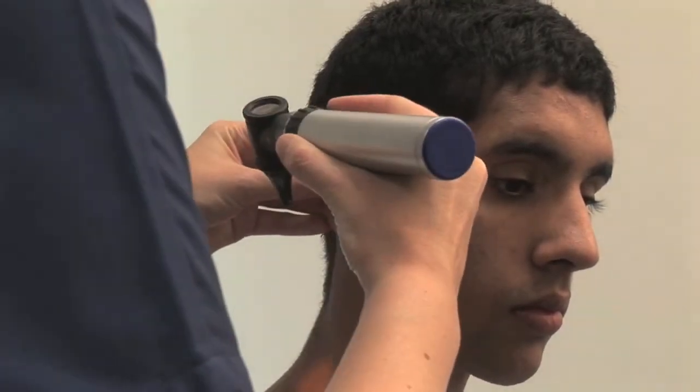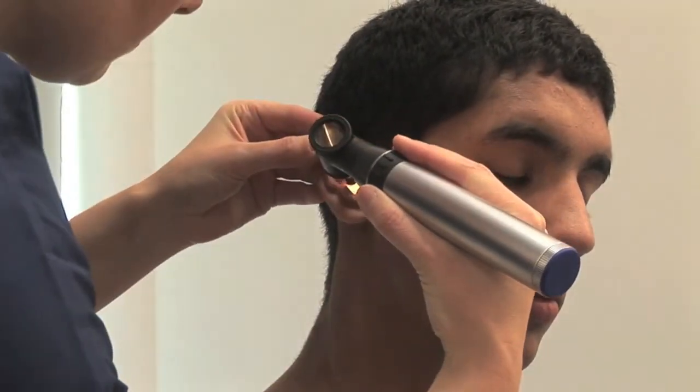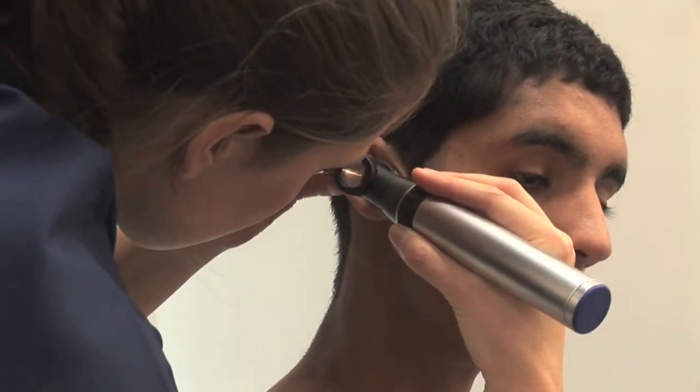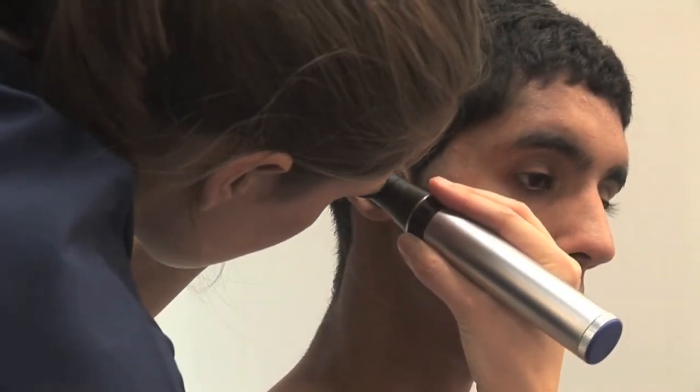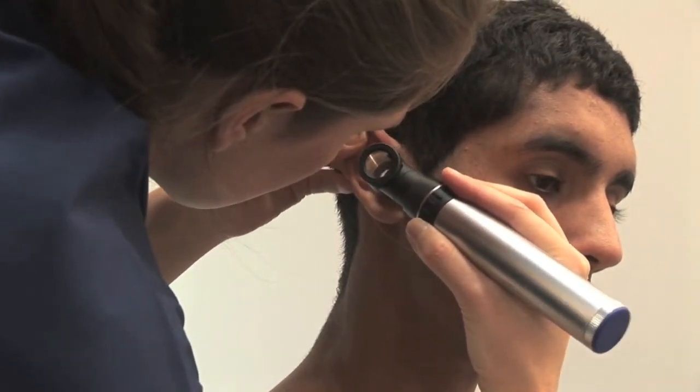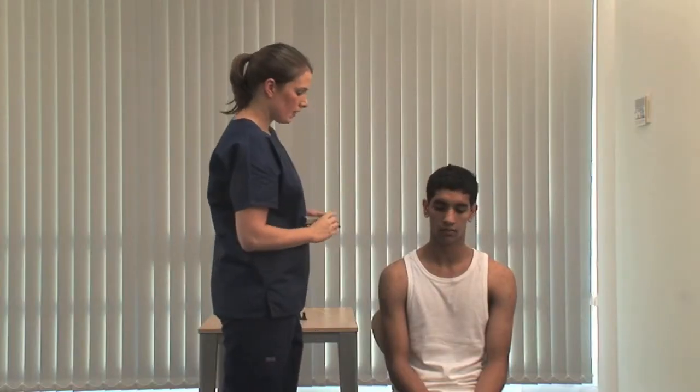I'm going to look inside your ear now. Get a comfortable grip of the otoscope and rest the ulnar border of your hand against the patient's cheek. Gently pull the pinna to straighten the canal. Thank you.